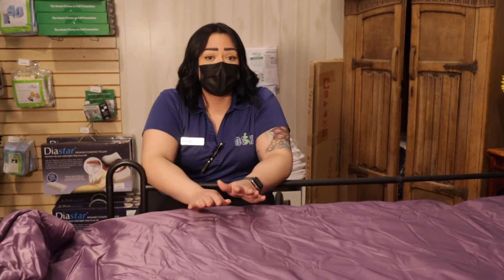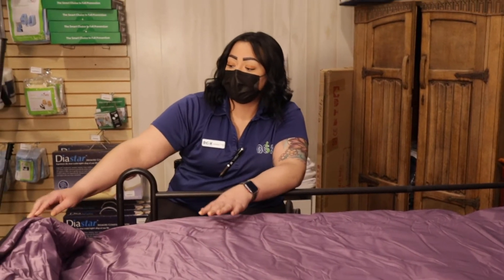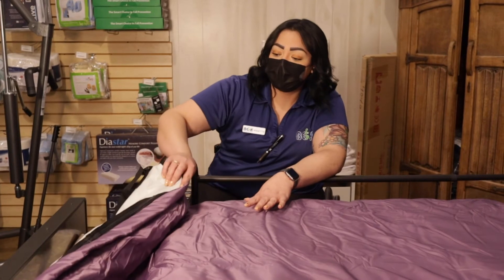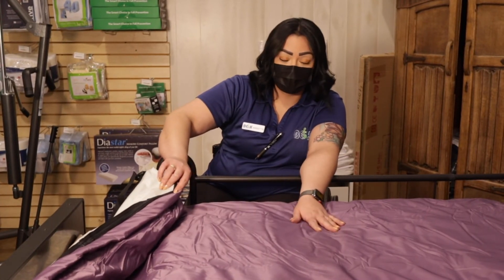We also carry some that go up to eight inches, and it has a zipper so you're able to completely remove it. It's super easy to clean underneath it and wipe it completely down.